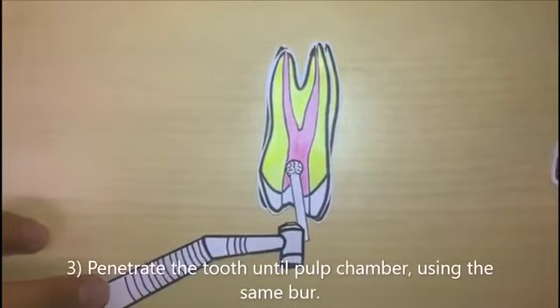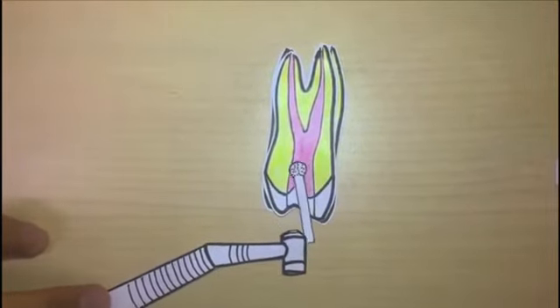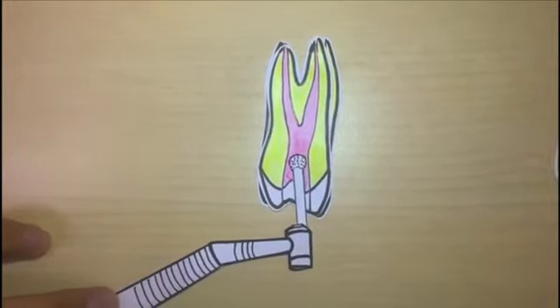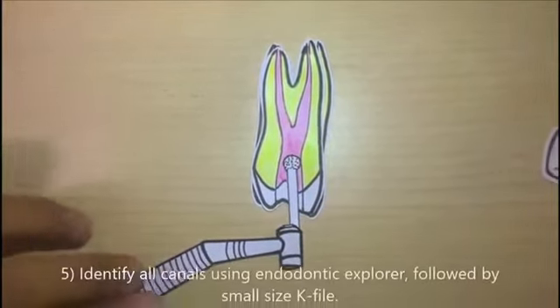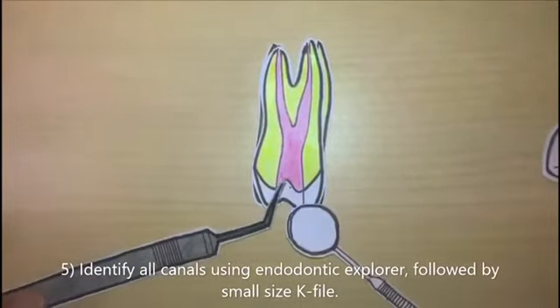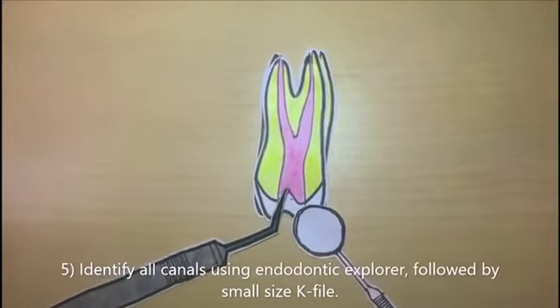Penetrate the tooth until the pulp chamber using the same burr. Remove the roof of the pulp chamber completely using a round burr or tapered fissure burr. Identify all canals using an endodontic explorer, followed by a small size K file.